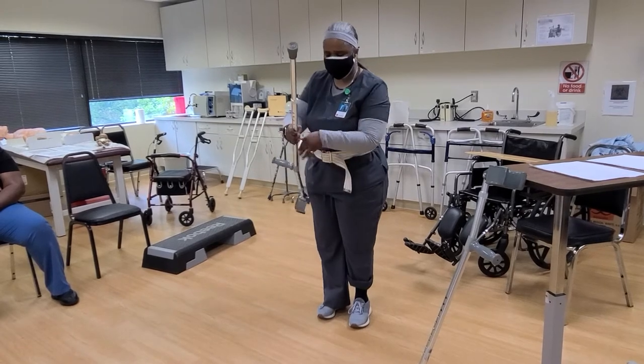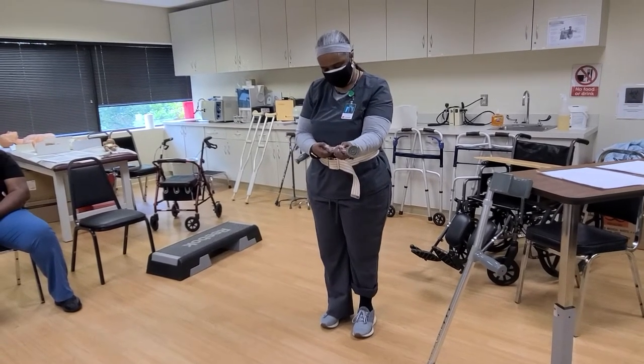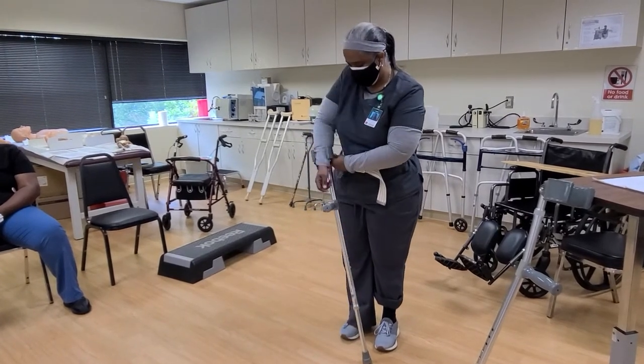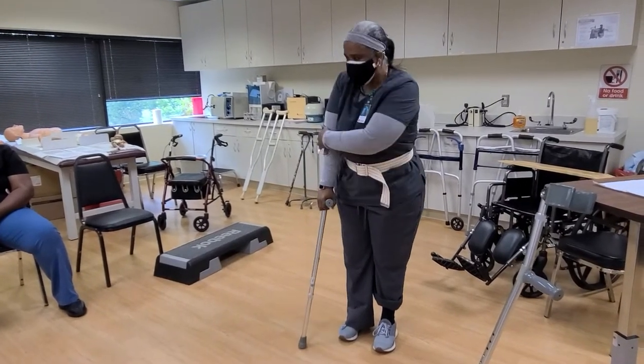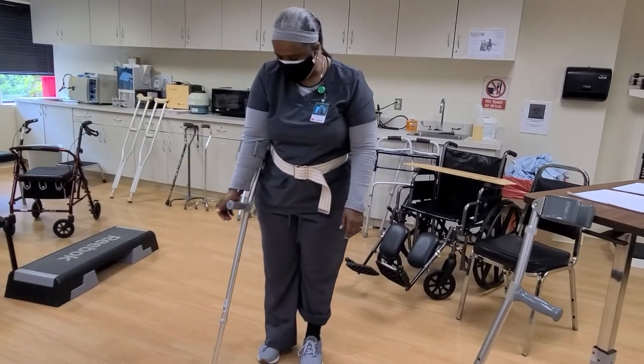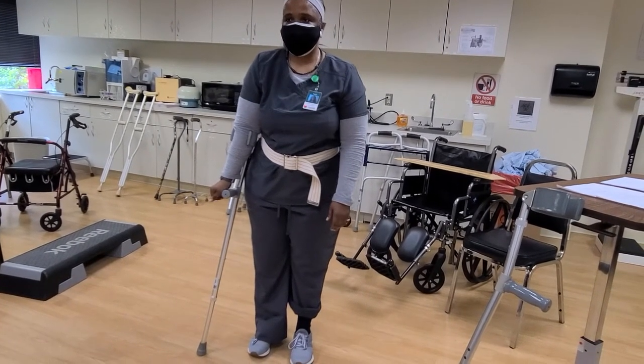It needs to be just below the bend of your arm. So I would need to adjust this — there, that's pretty good, just below the elbow.